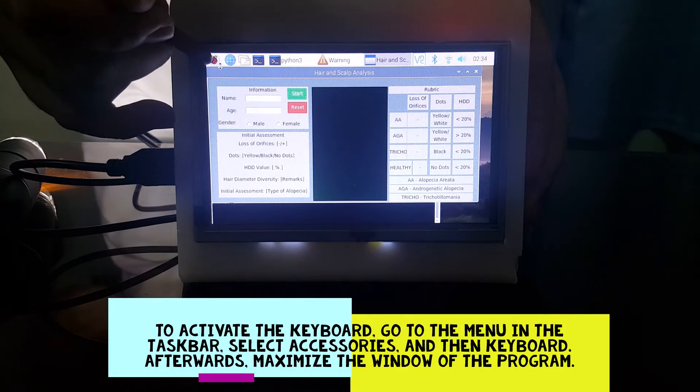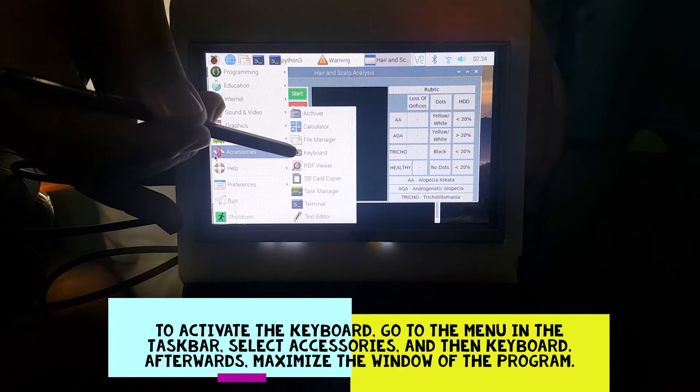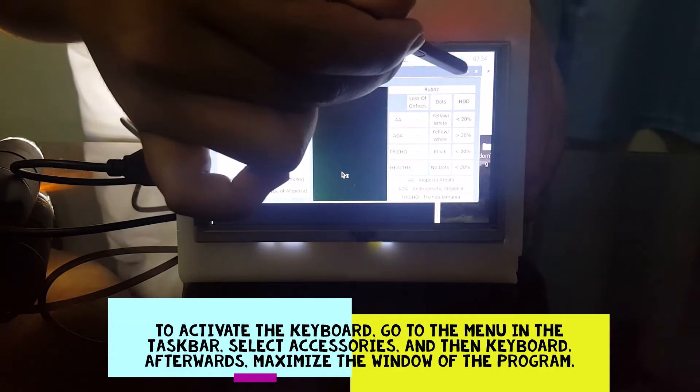To activate the keyboard, go to the menu in the taskbar, select Accessories, and then Keyboard. Afterward, maximize the window of the program.